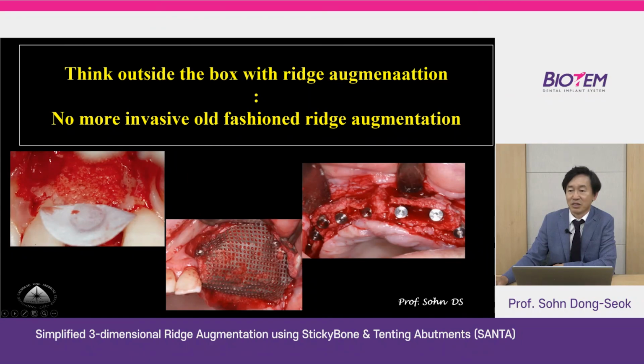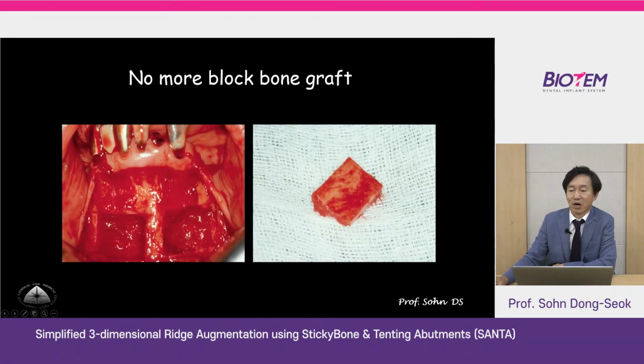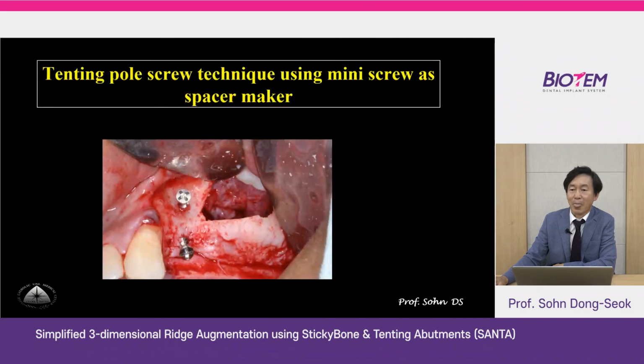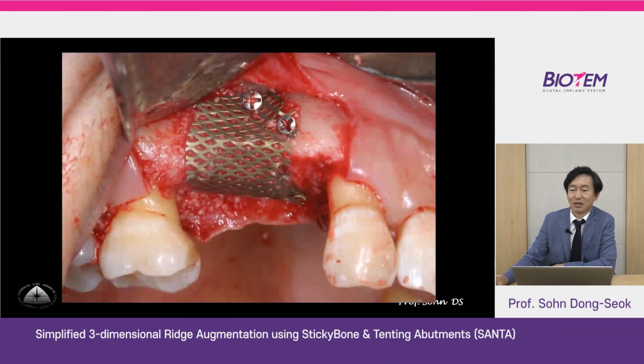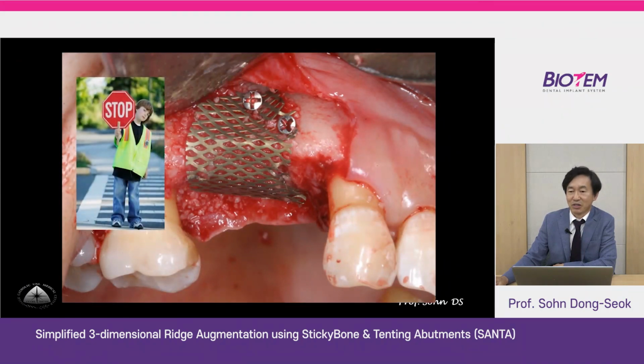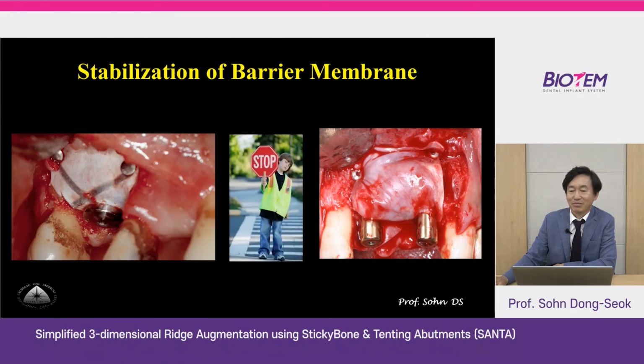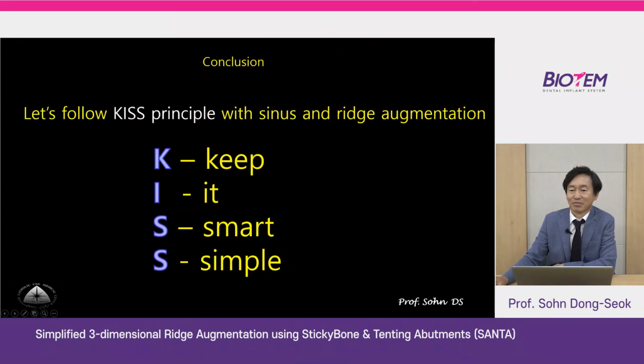No more invasive old-fashioned ridge augmentation as shown on this slide. No more block bone in my practice. No more bony plate in my practice. No more tenting pole screw in my practice. No more titanium mesh in my practice when I place the implant simultaneously. No more stabilization technique for the membrane. This is not an easy job.